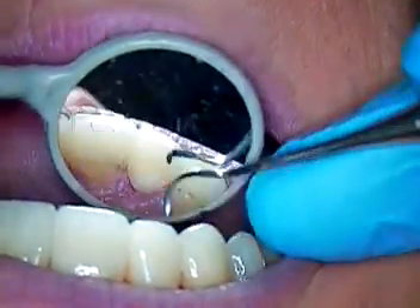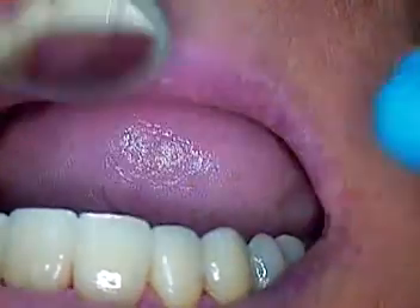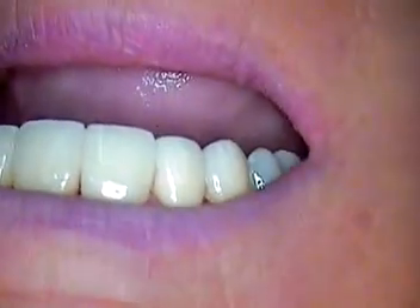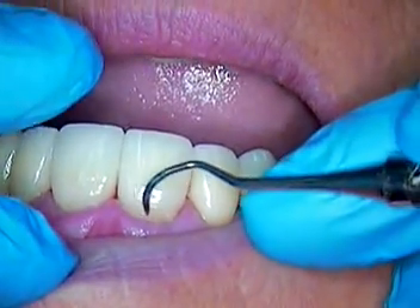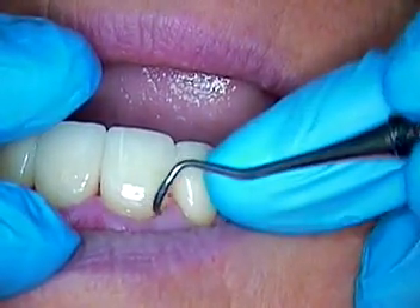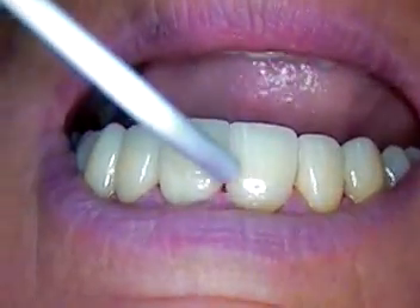I just went through with some polishing abrasives, and we still have some cleanup to do, just to show you the final arrangement. Of course, the tissue right now is a little angry, and we're going to recall her in a week. I'm going to continue to look for cement on these.